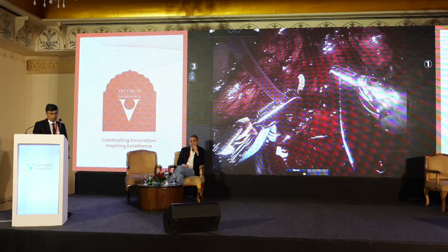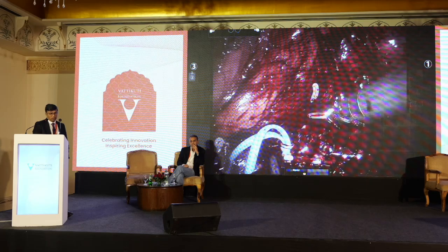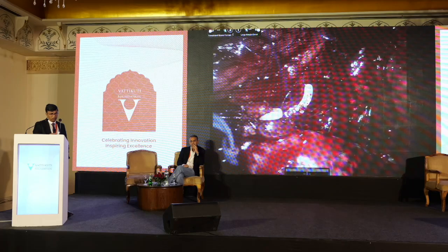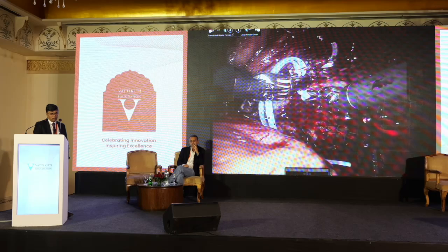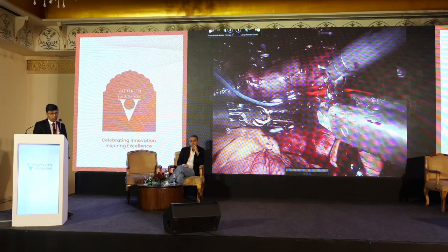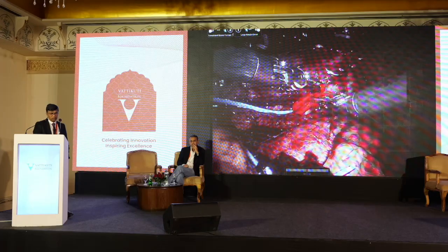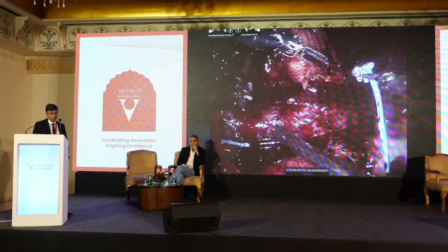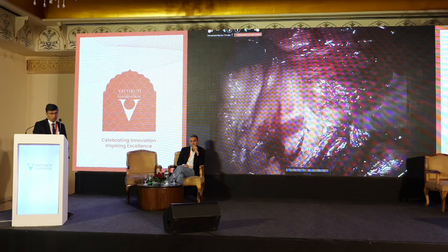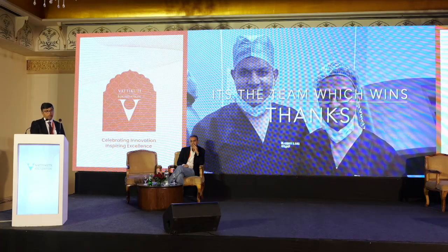And lastly, we flush the IVC with heparinized saline. And to prevent the bursting effect, we take a knot here and then we come back again to have a double layer suturing. And then once you remove all the clamps, there will be minimal ooze, and I think for transplant surgeons, it is very easy to know that this kind of ooze will subside. Just put a gauze there and it will go off. Now you take care of the kidney and do the procedure.